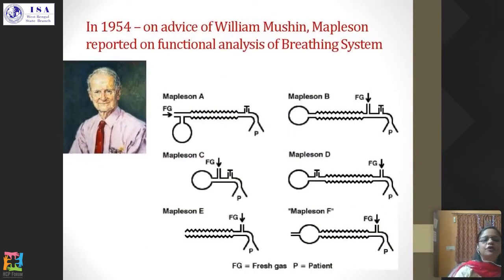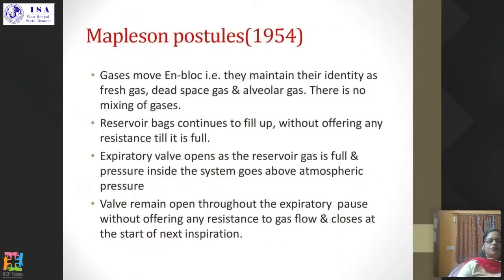Now, in 1954, on the advice of William Mushin, Mapleson reported on the functional analysis of the breathing system and classified the Mapleson circuits. Now, what are the Mapleson postulates? Mapleson postulates, which were published in 1954, are: gases move en bloc, that is, they maintain their identity as fresh gas, dead space gas, and alveolar gas. There is no mixing of gases. The reservoir bag continues to fill up without offering any resistance till it is completely full. The expiratory valve opens as the reservoir bag is full and pressure inside the system goes above the atmospheric pressure. And the valve remains open throughout the expiratory pause without offering any resistance to gas flow and closes at the start of the next inspiration.